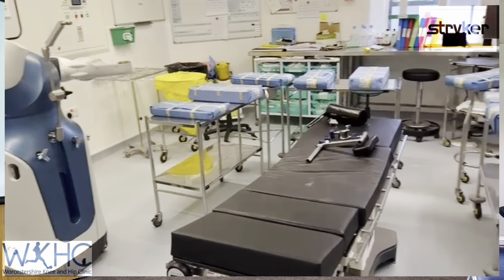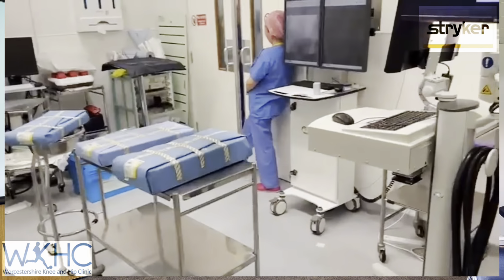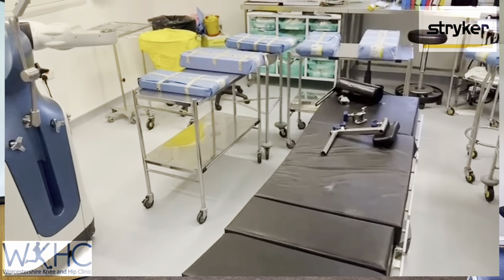That's a sort of typical setup there. And then you can see the camera there, which is set up there. You can see somebody hiding there. So that's the setup that we use for a knee.